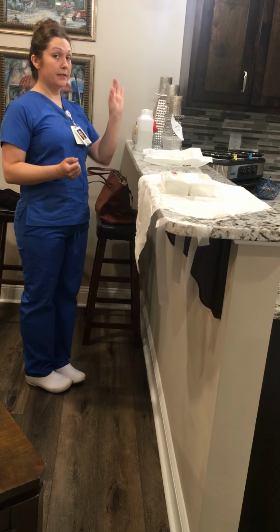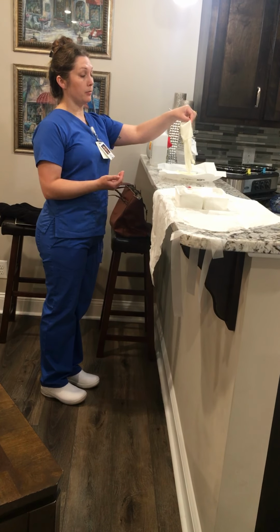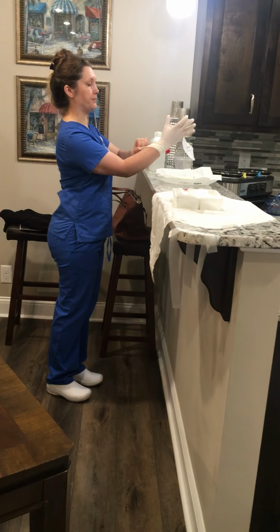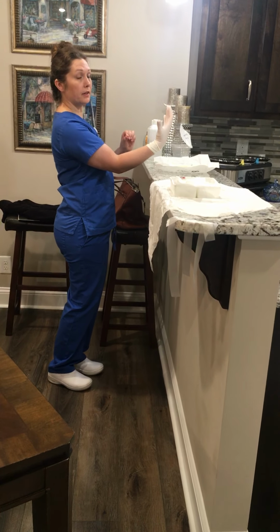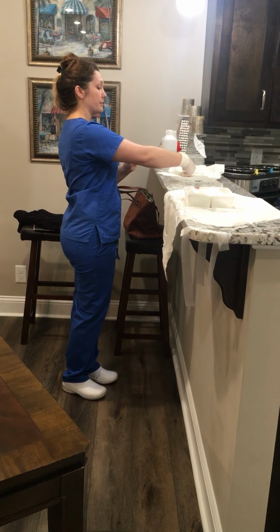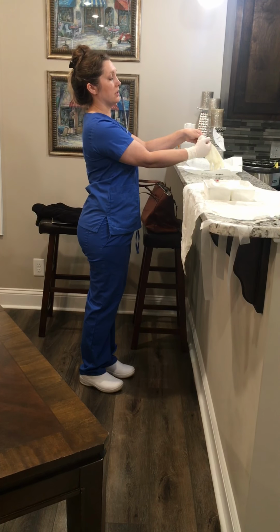So I'm going to take my left hand and I'm going to pinch the cuff of the right glove, okay? I'm going to lift it, making sure not to go above my shoulders, and I'm going to stick my hand in and pull down. This is still cuffed. Once I put my other sterile glove on, I can fix that, but for now I'm just going to leave it. Now I'm going to take my right hand and cuff the left glove, raising it up, but not too far to where I'm going above my shoulders, and sticking my hand in.